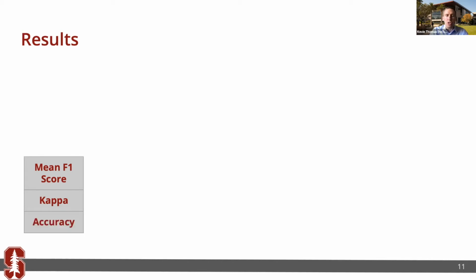And the last metric I'll show today is accuracy. And this is simply how many images the model is correctly labeling. But it can be a little bit misleading for some data sets because for our osteoarthritis initiative data set, for example, there was some data imbalance, meaning we had a different number of images in each of our KL scoring categories, which can shift the priority so that accuracy isn't a balanced metric of performance, but it's intuitive, so I'll show it here.